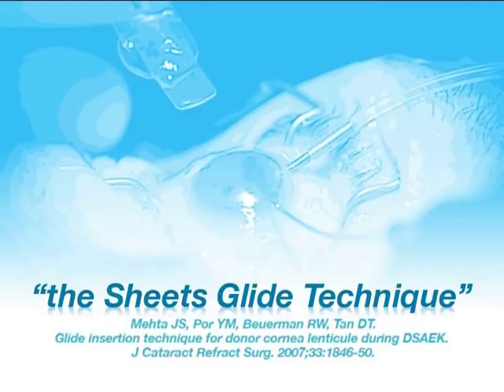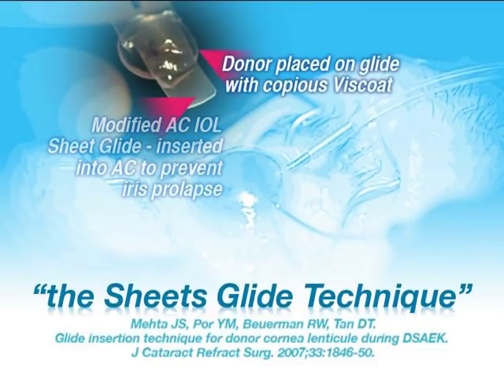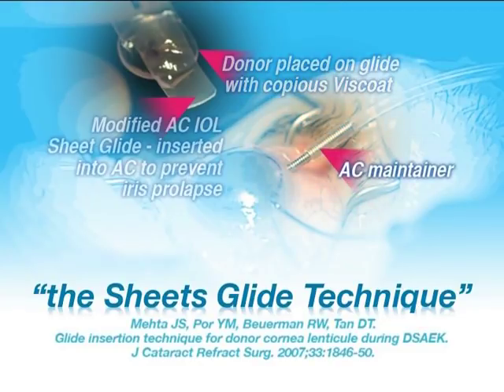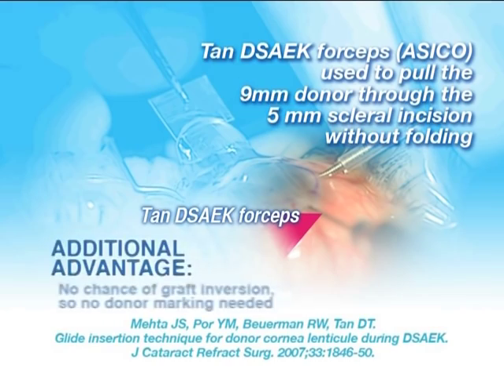We have developed a simple and effective technique using a modified anterior chamber IOL sheets glide, enabling insertion of the donor without folding into an anterior chamber deepened with an AC maintainer. This technique is ideal even in small eyes with high vitreous pressure, as the glide prevents iris prolapse when the wound is opened. The donor is pulled through with the use of a Tan DSAEK forceps, which has also been developed.